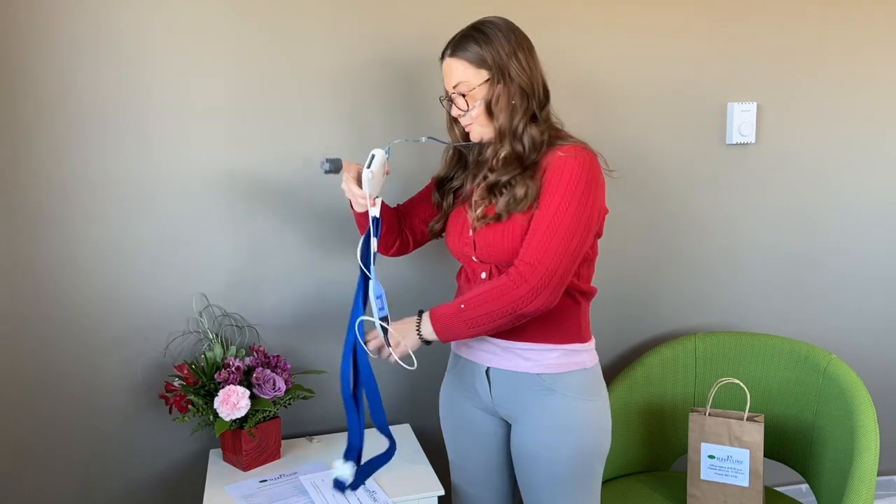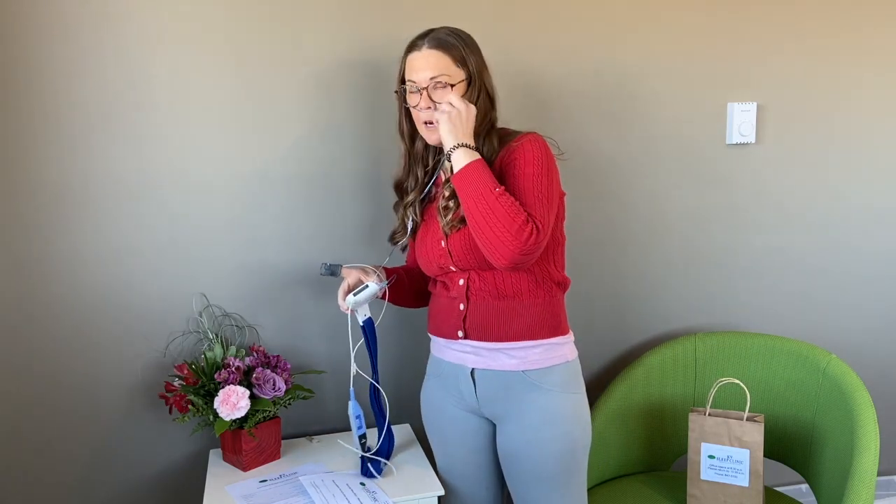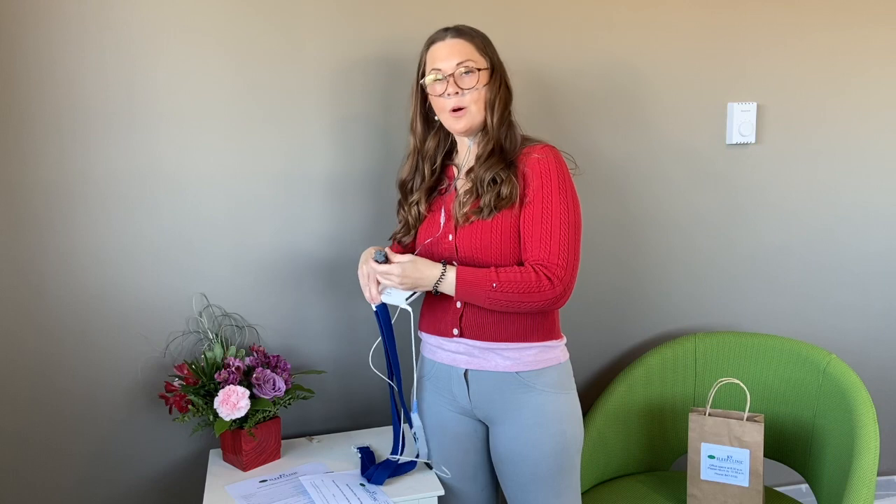When you get up in the morning, all you need to do is disconnect one side of the belt, take off your cannula, and take off your finger probe and put it to the side for the next day. Then do it again your second night.